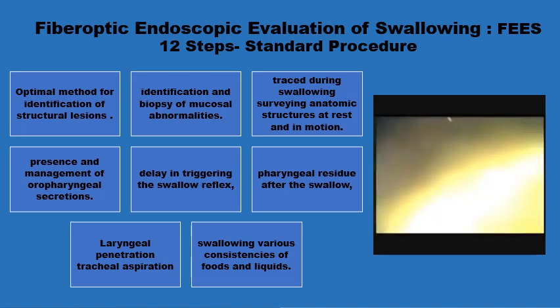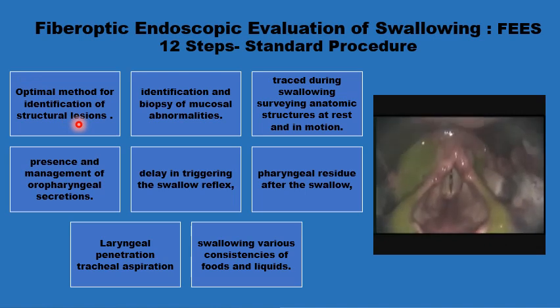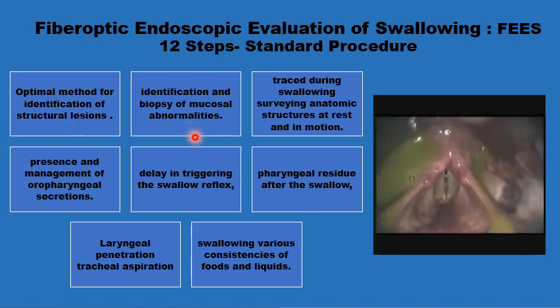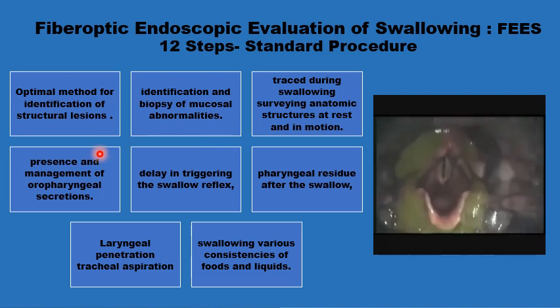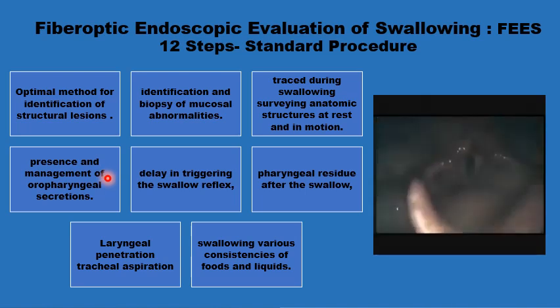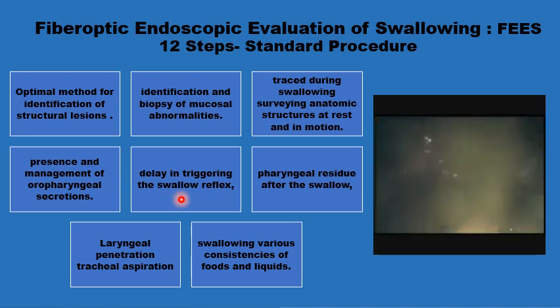It starts by scanning the larynx and the pharynx for any structural abnormalities. If this can be biopsied, it can be done during the same procedure. You should also be in a position to see if there are any retained secretions or saliva in the pharynx and assess if there is any delay in the triggering of the swallow reflex.